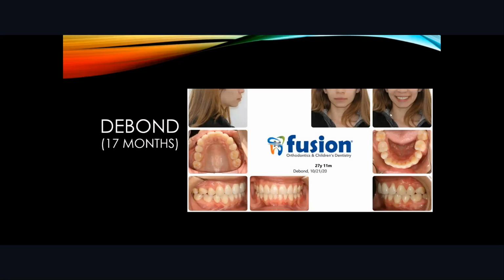Why? One, teeth are more malleable. I'm thinking that probably the PDL is more stretched all around. It's only a hypothesis, hasn't been tested or evaluated. But the second reason is we have these attachments behind the teeth that work like a charm. They are huge. They give us a good mechanical advantage that allows us to do the movements that we need.